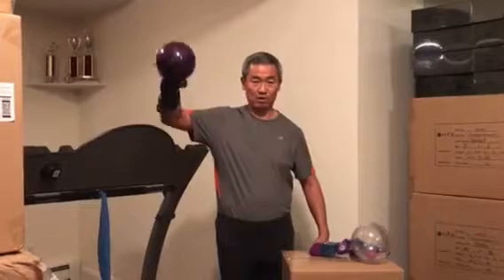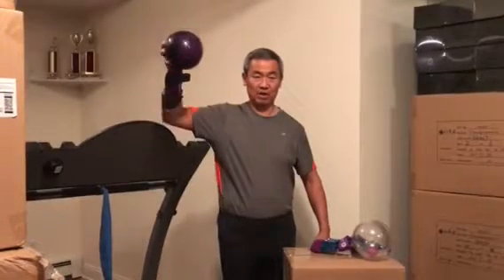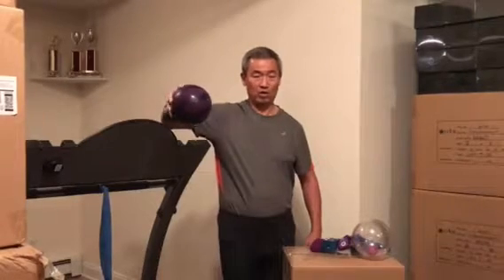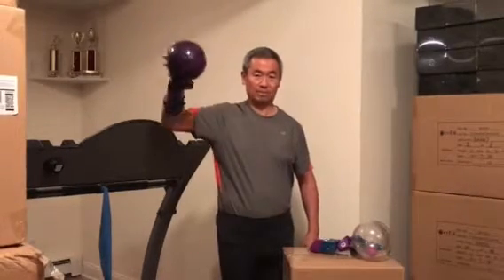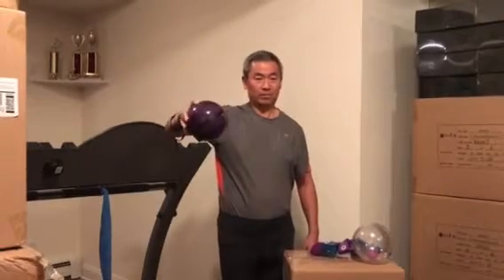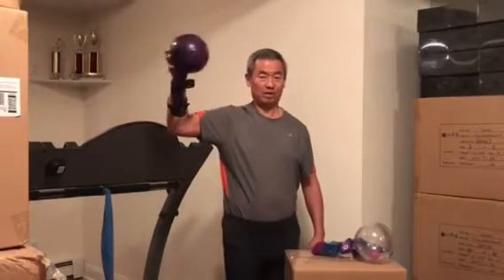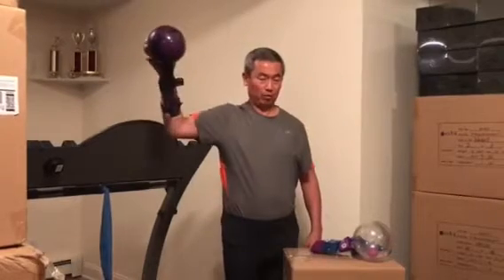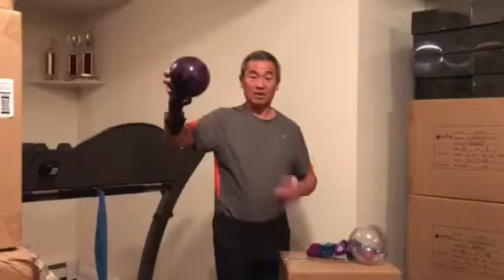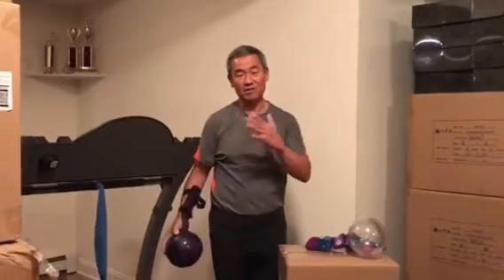So they start from here, go up to the neutral, and come down. So you start from here, so you get it, start rolling. So this is 1, 2, 3, 4, 5, and so forth. So that completes the cycle.